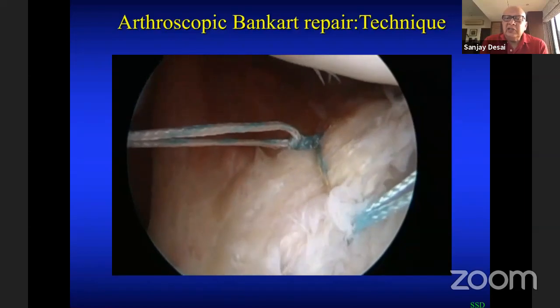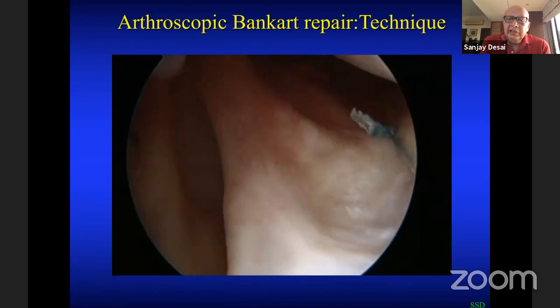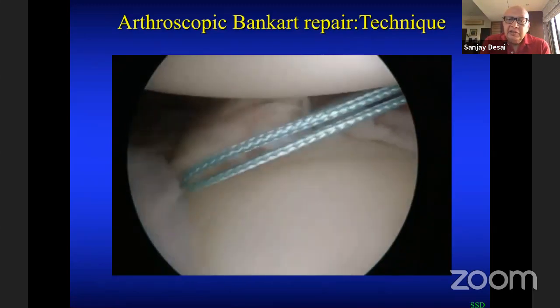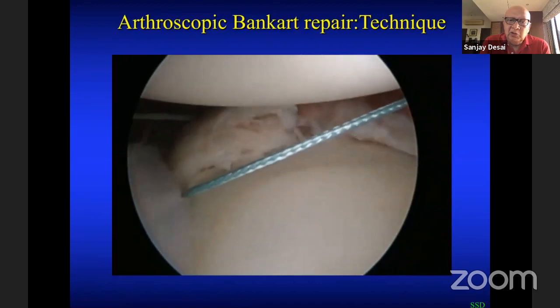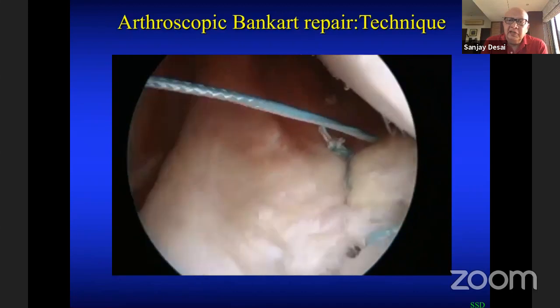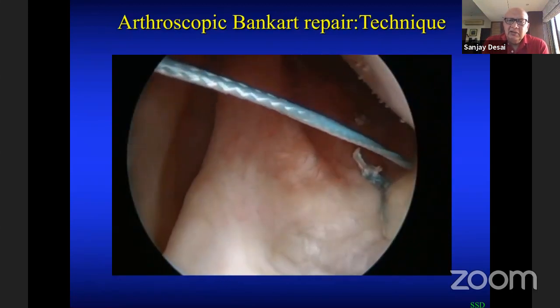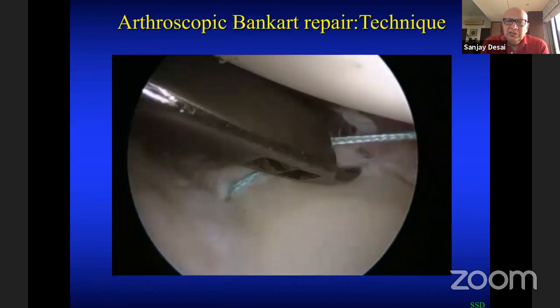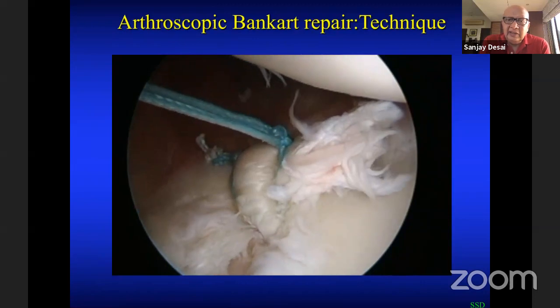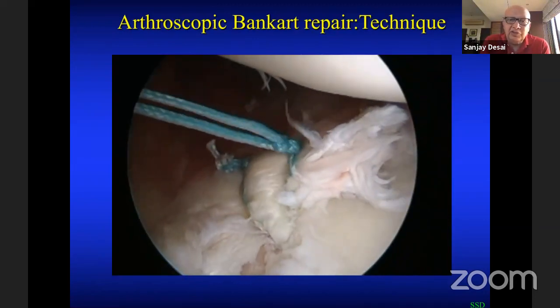The 4th and 6th knots are locked, and you cut it. And then you repeat the same step with 2 more anchors. This is the lowermost anchor. And if you see here, I'm passing this suture further down inferiorly for the lowermost anchor, because I want to tackle the inferior part the most in recurrent anterior dislocation of shoulder, not just the anterior part of the soft tissue.